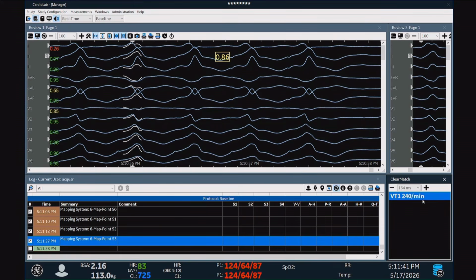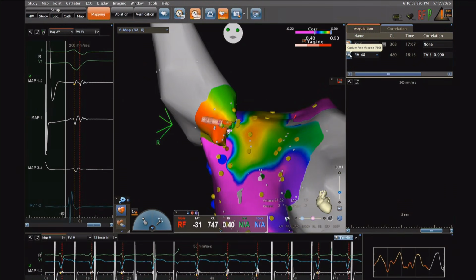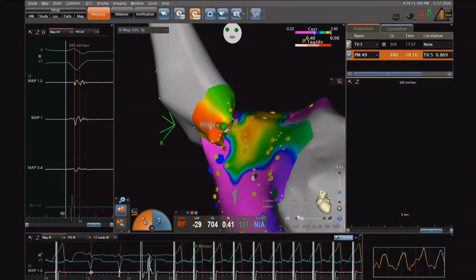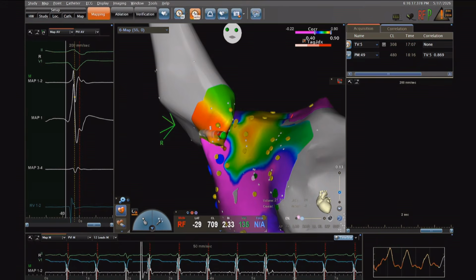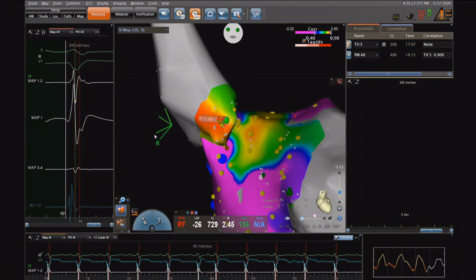Maybe we can try to pace again here and decrease. Oh, the output is 5. It's okay. You have to increase a little bit, and we'll see. Okay, we capture here, pushing down. It's 97. But you get the 90, and usually in those areas, it's very difficult to be above 90. 95 is very unusual.